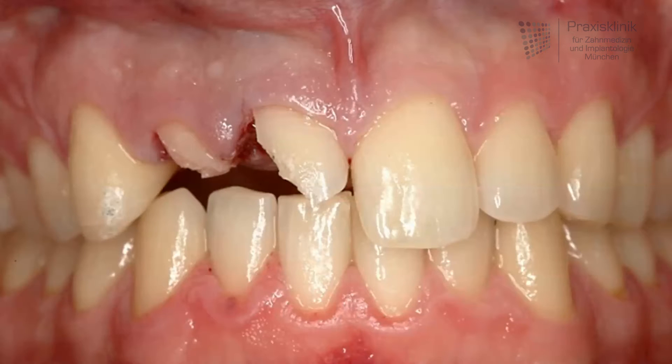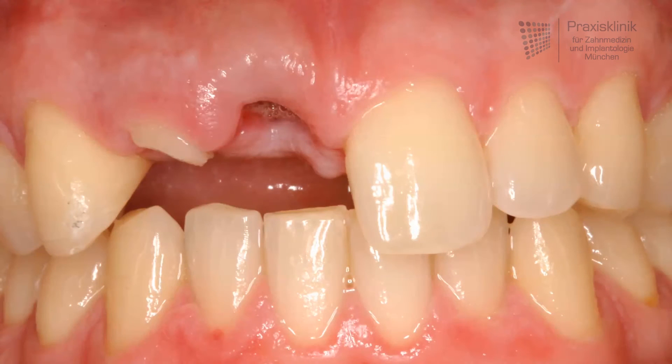The following picture shows the situation one week after the extraction of the central incisor. Normally the implant placement should be done immediately after the extraction, or in a delayed manner up to eight weeks after the extraction.